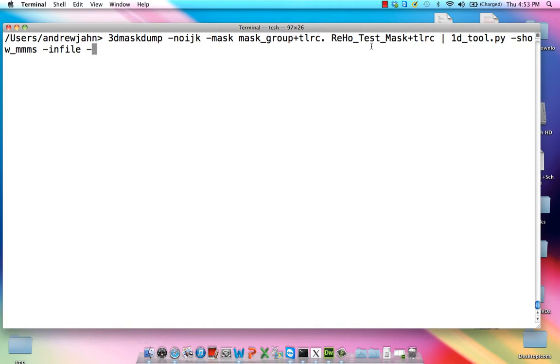You could use a more specific mask, like a gray matter mask, if you're only interested in voxels within the gray matter. That's a perfectly valid approach, but for right now, I'm just going to focus on the whole brain.